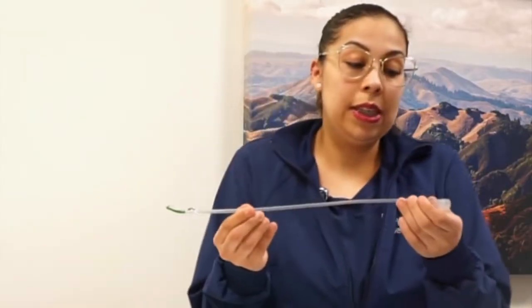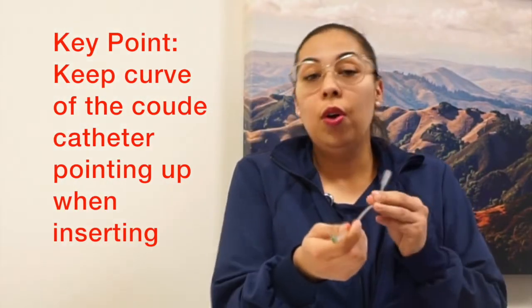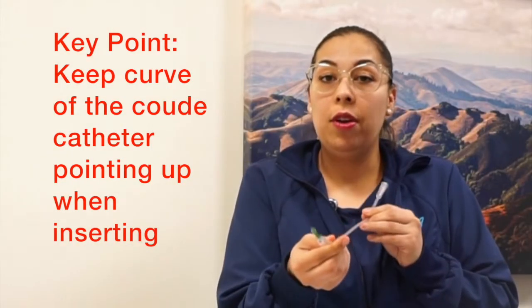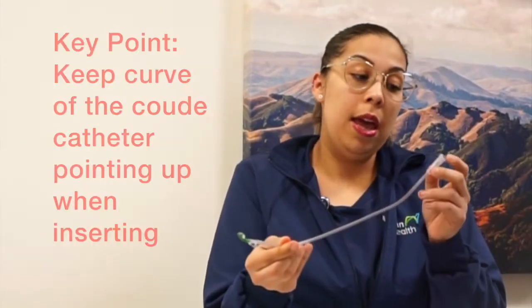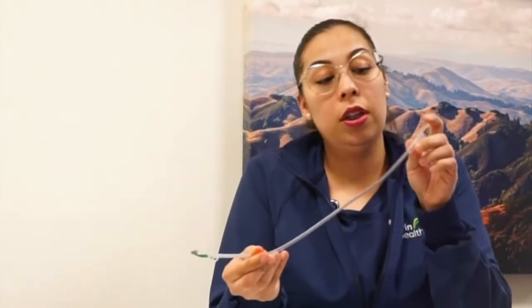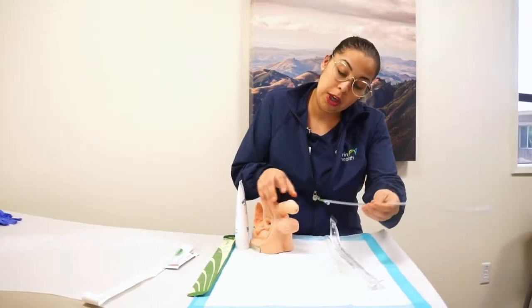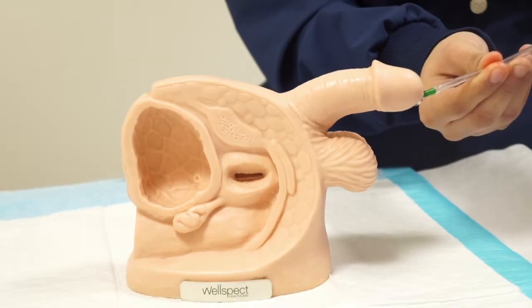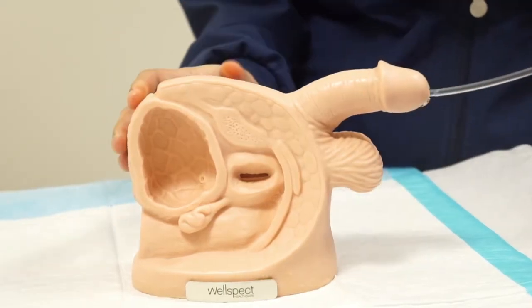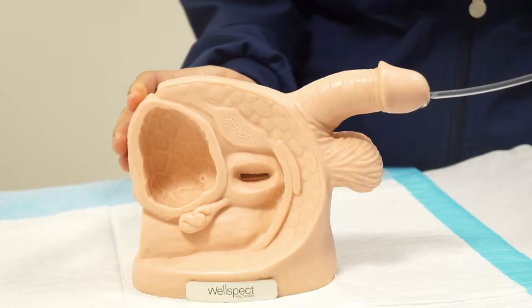It's really important with these catheters — there is a curve on the end of the catheter. You have to make sure that the catheter is always pointing up. The curve has to go up all the time, and they have a little neck on the top. So how do you know you're putting the catheter in the right way? When introducing the catheter through the urethra, you have to point the tip up.